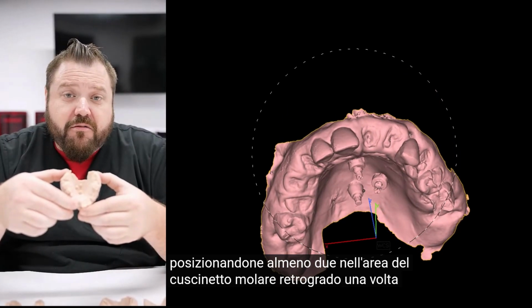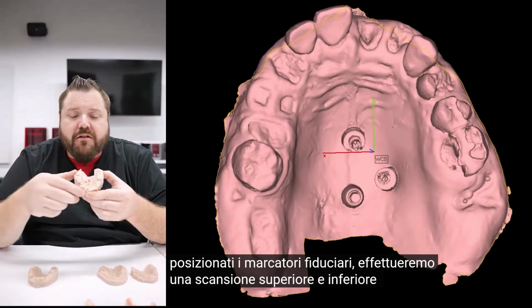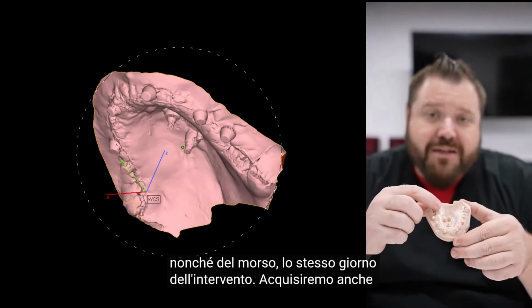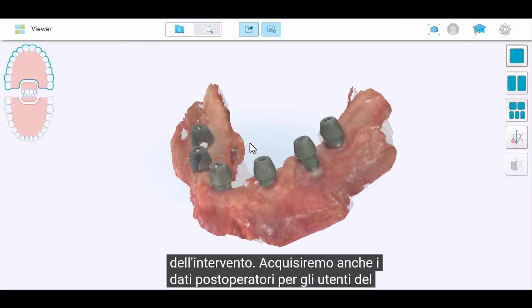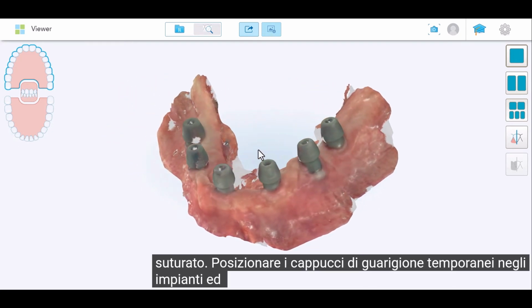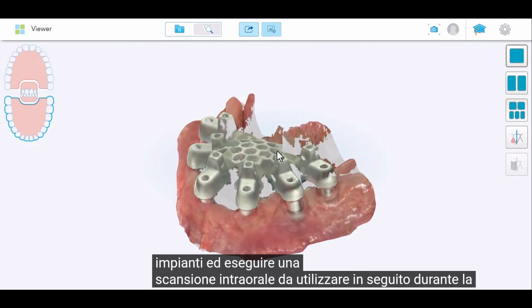Once the fiduciary markers have been placed, we'll be taking an upper and lower scan of the patient as well as the bite. On that same day of surgery, we're also going to be capturing the post-op data. For users of the OptiSplint system, once the tissue has been sutured, place temporary healing caps in the implants and perform an intraoral scan for use later during appliance design.